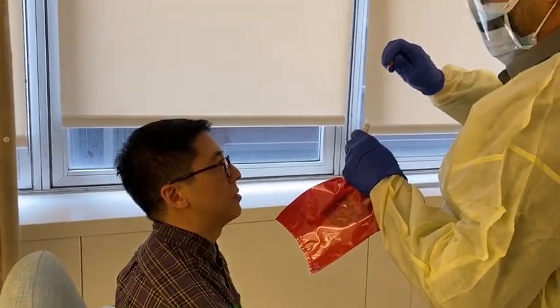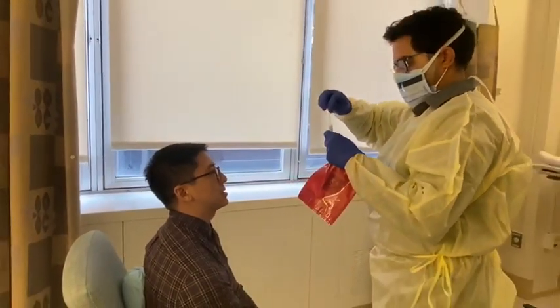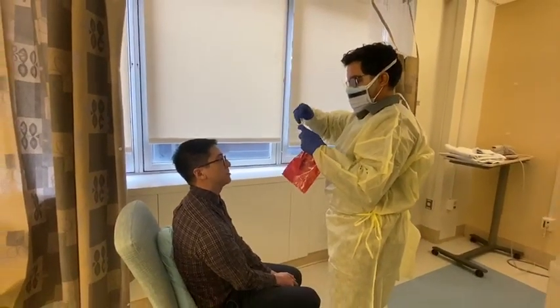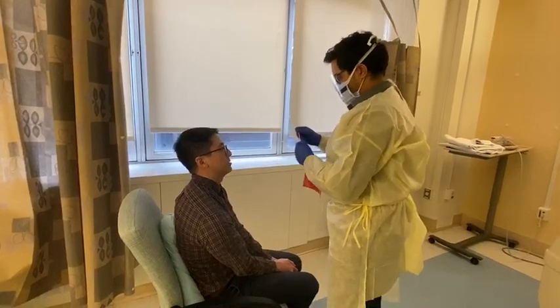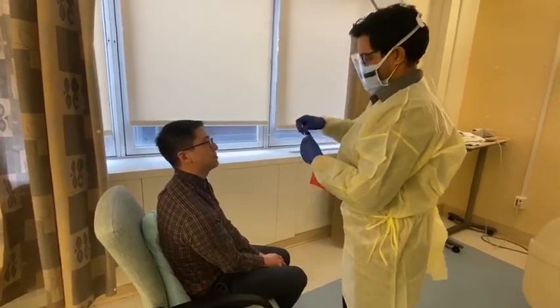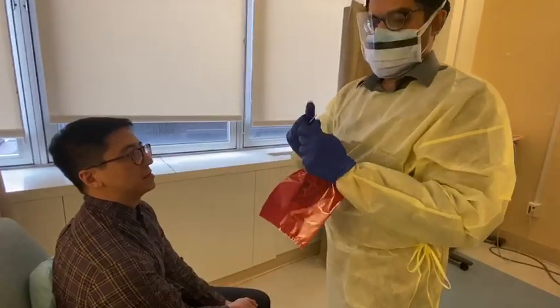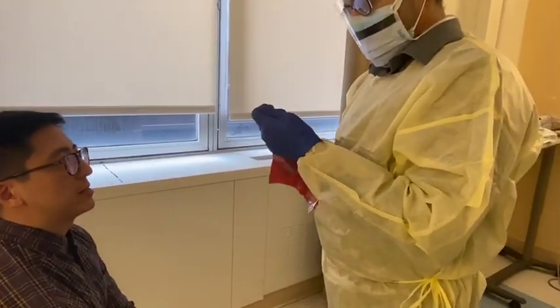Then he's going to put this swab into the collection tube, straight in. He's going to swirl it around the media. And then for the pink tab, he's going to snap it off, and then it drops right in.